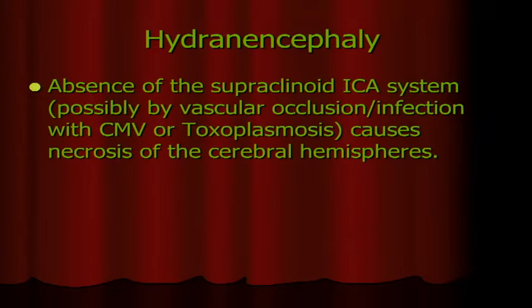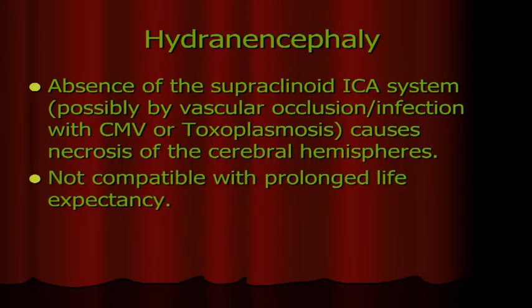Hydranencephaly: absence of the supraclinoid ICA system, possibly vascular occlusion, infection, CMV, toxo, which causes necrosis. It's not compatible with prolonged life expectancy.